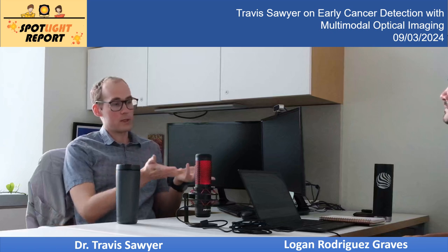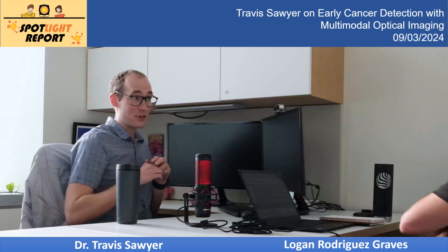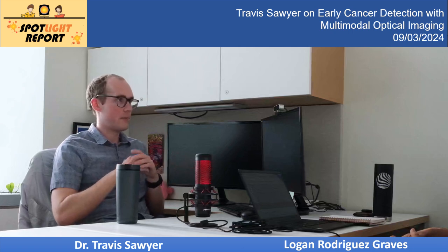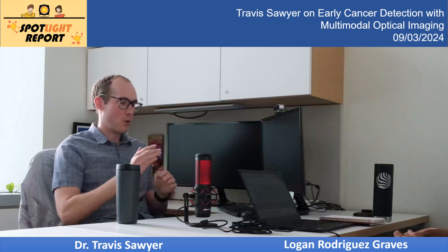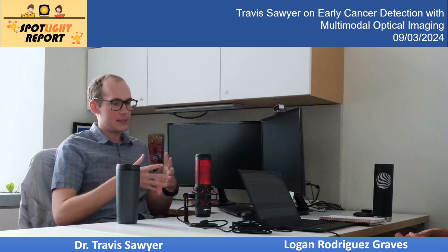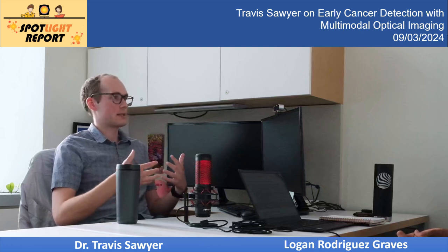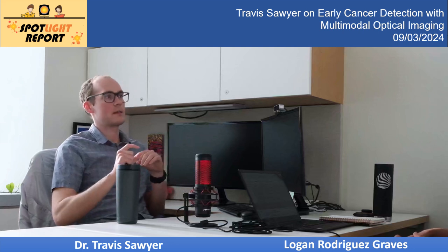A lot of my work was focused on quantification of these images. Which I really liked. We'll get into how you did that. Sure. Yeah, definitely. But I think it's important because ultimately you do want to have some kind of nice benchmark or threshold that says, okay, this is a dangerous point, and below that, maybe not, above that, maybe so. But OCT is good for all those sorts of things. It's also pretty robust to things like working distance. Yes, you have to be some working distance away, but it's not super sensitive to it.